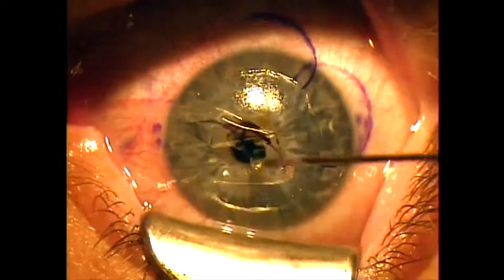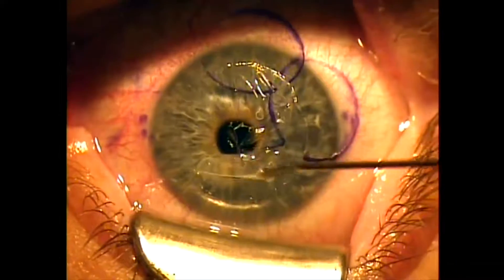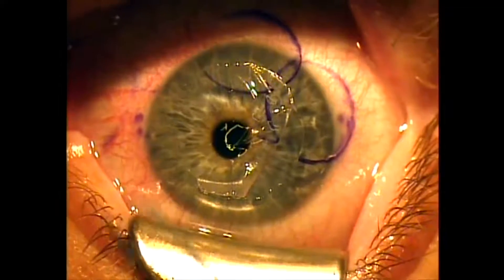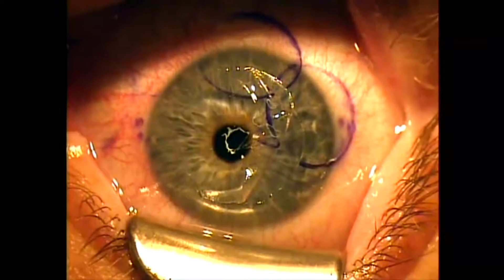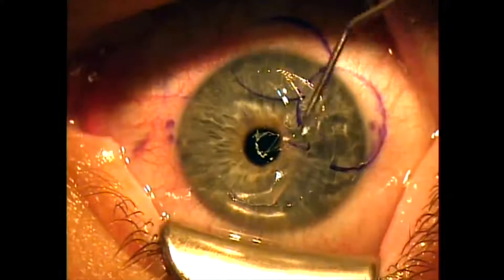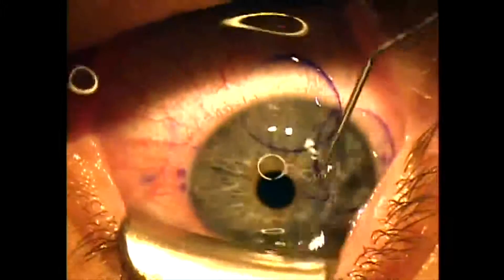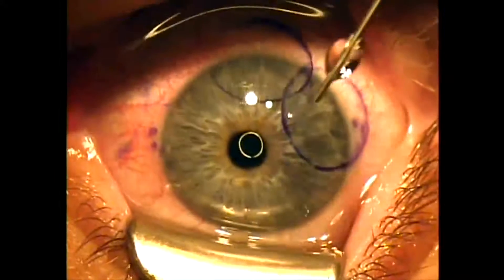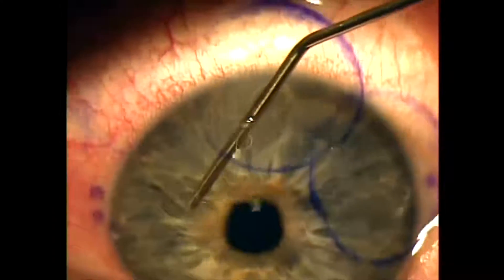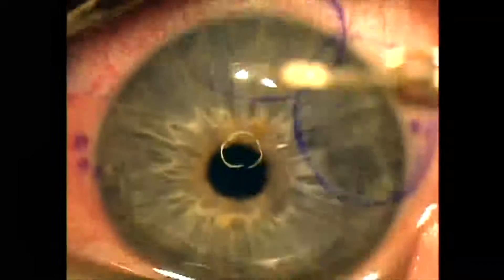We then lay the flap back down. Our goal is to make sure there are no epithelial cells that get tucked underneath the flap edge. I identify a little particulate debris at 6 o'clock, so I use a 0.12 forcep to remove that little filament so it doesn't inadvertently get tucked underneath the flap. I then just float the flap back onto a layer of balanced salt solution and then smooth it out. I try to align the gentian violet ink marks as I lay my flap back down. I am paying close attention to the flap edge to make sure no epithelial cells are tucked underneath that flap edge.